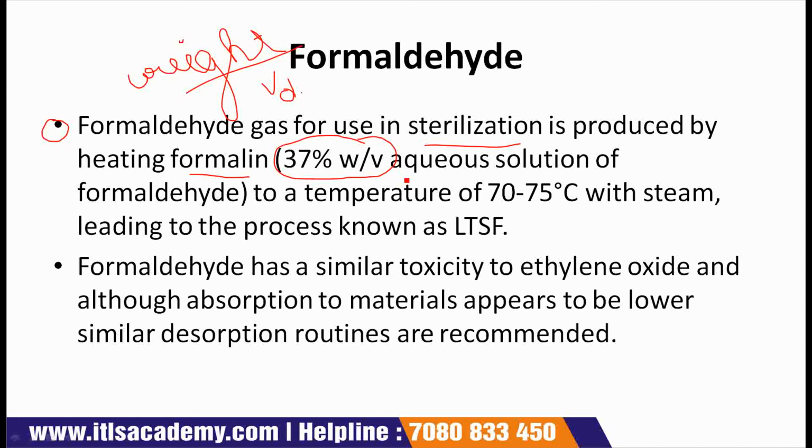This 37% weight by volume aqueous solution of formaldehyde is heated to a temperature of 70 to 75 degrees centigrade with steam, leading to the process known as LTSF.